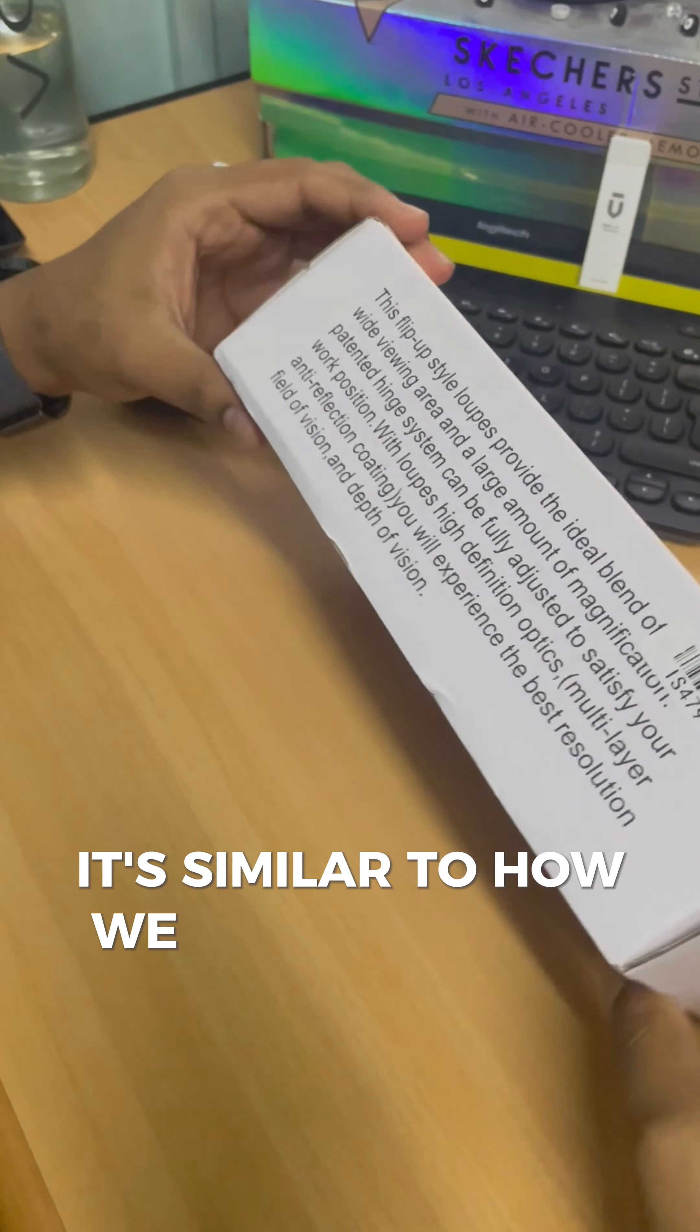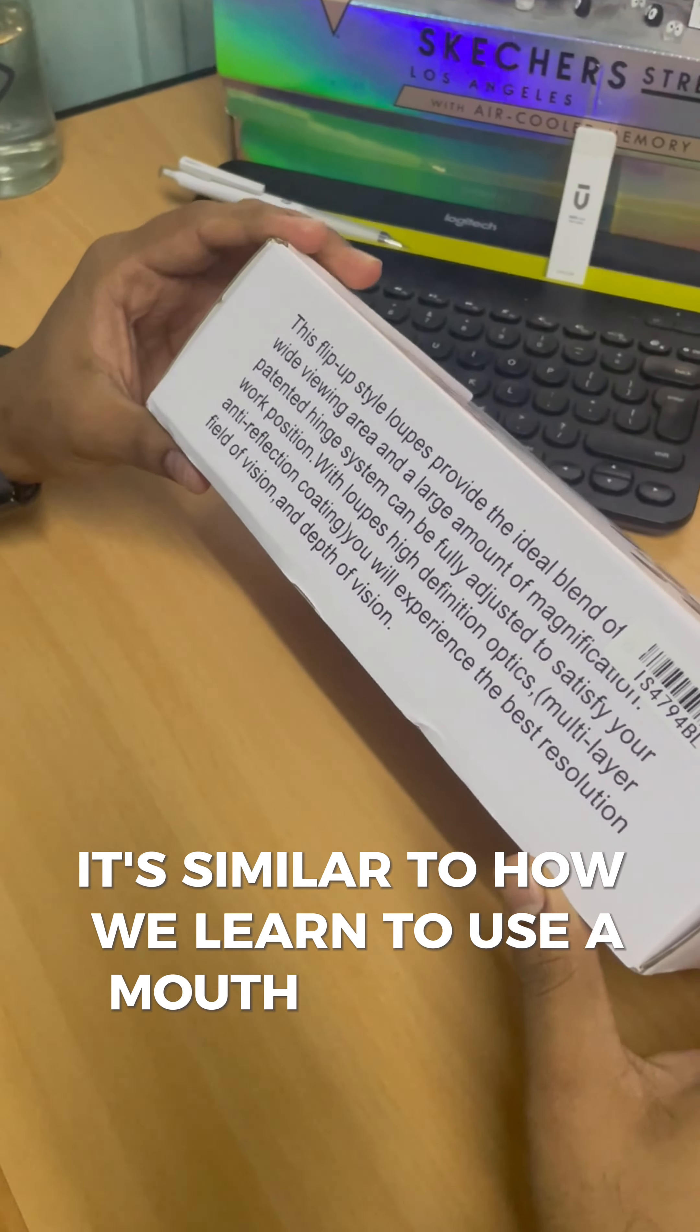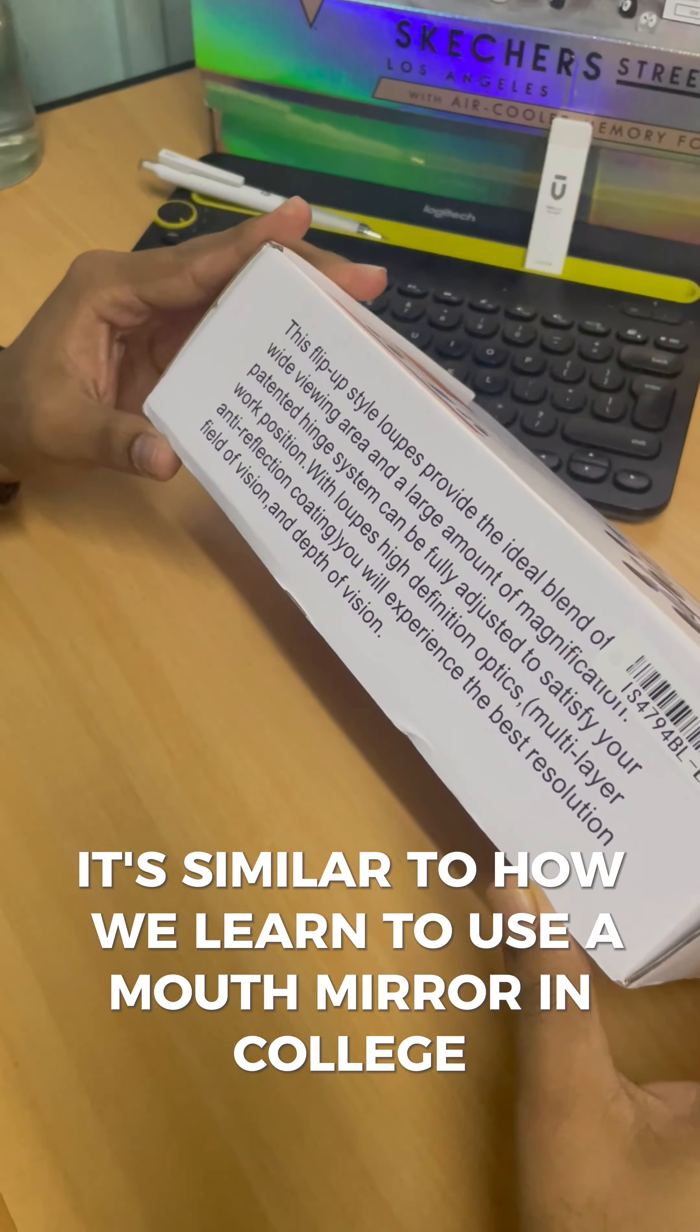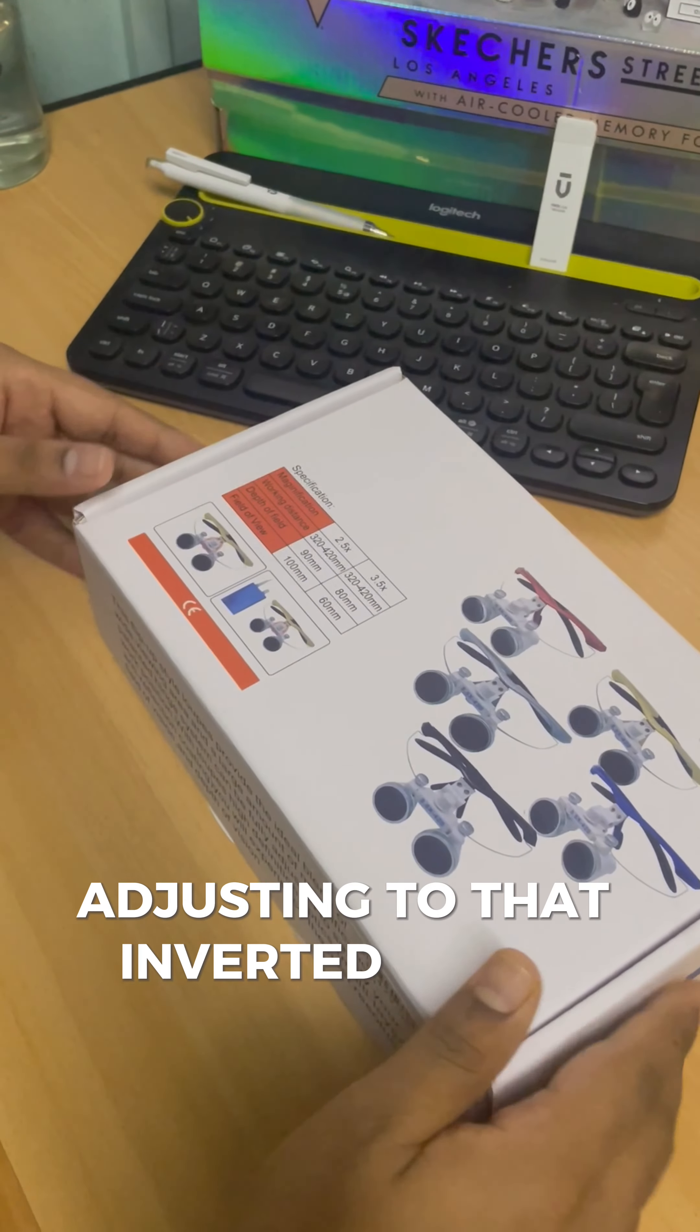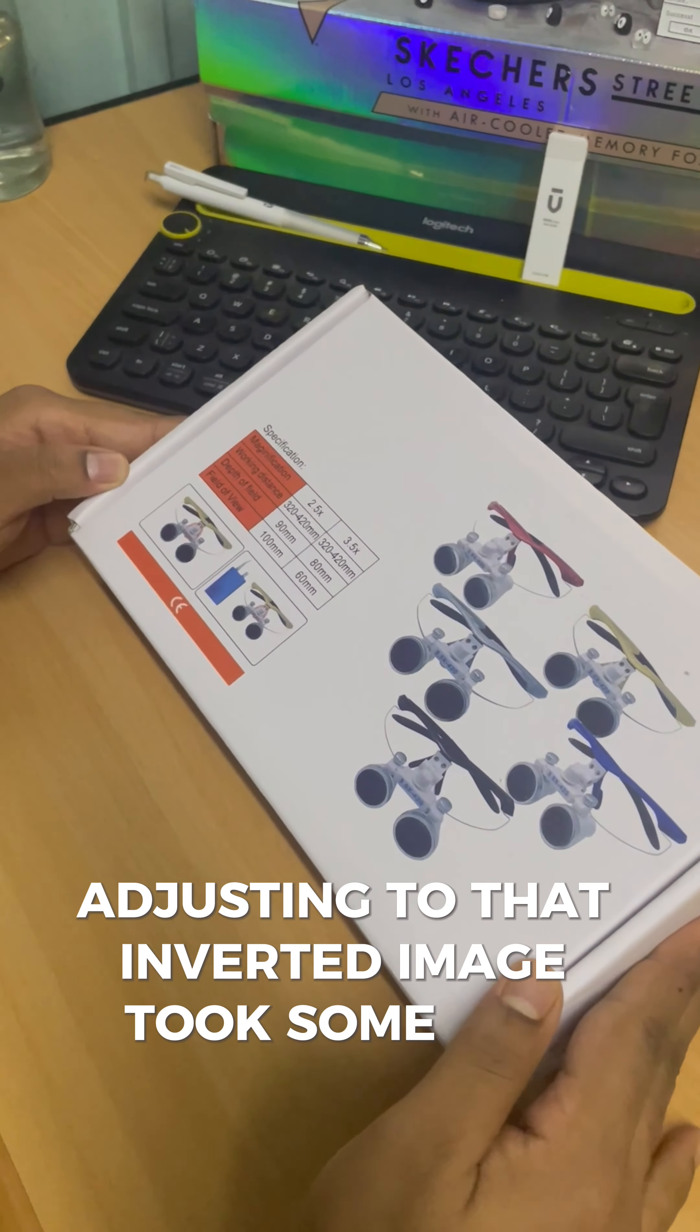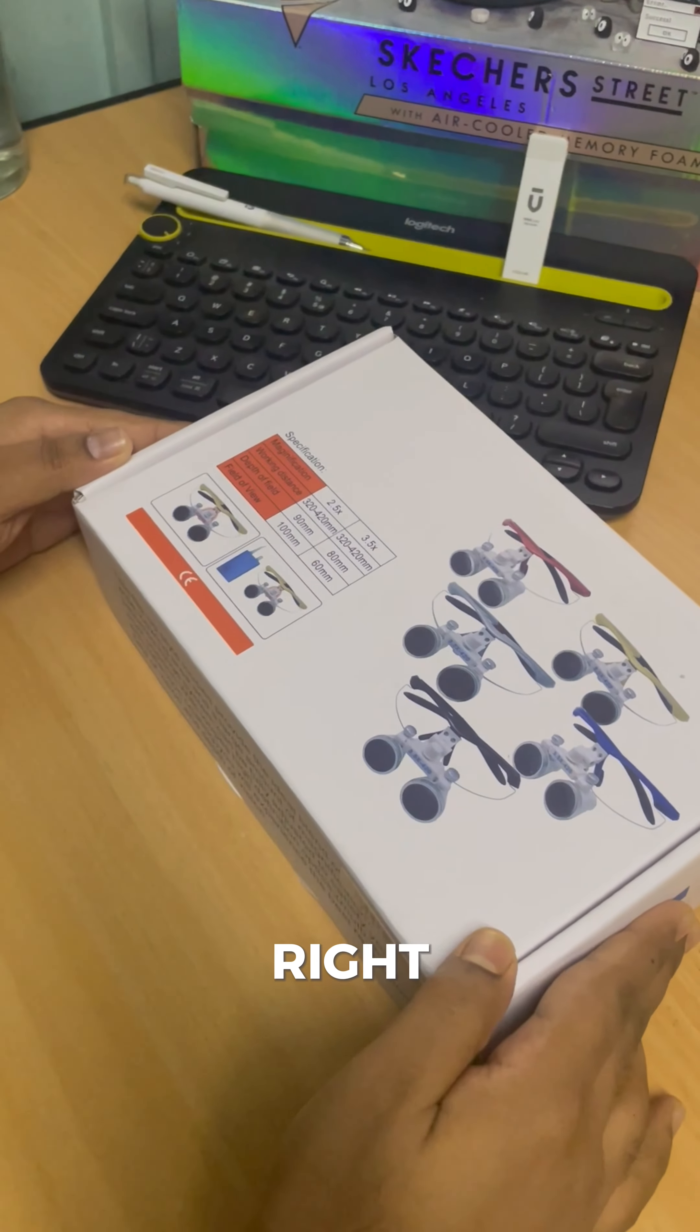It's similar to how we learned to use a mouth mirror in college. Adjusting to that inverted image took some time, right?